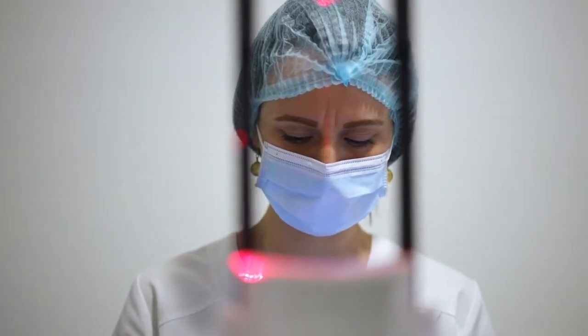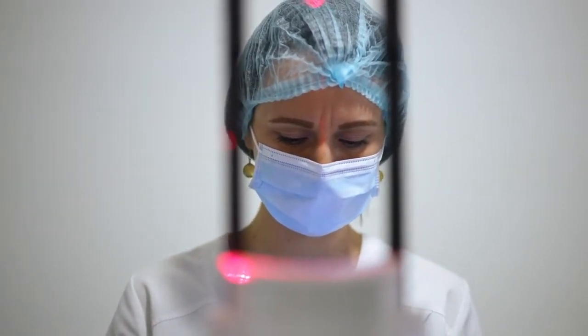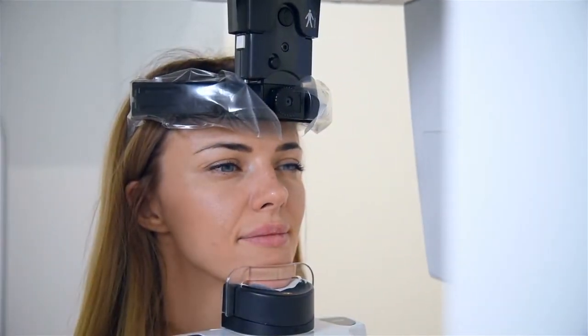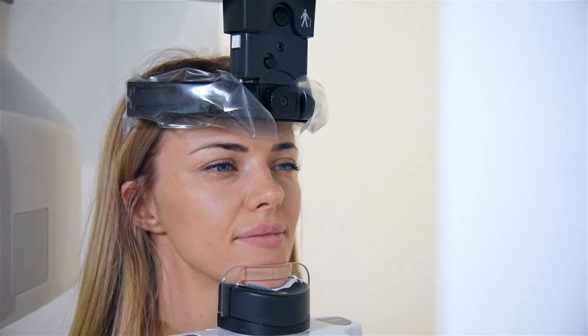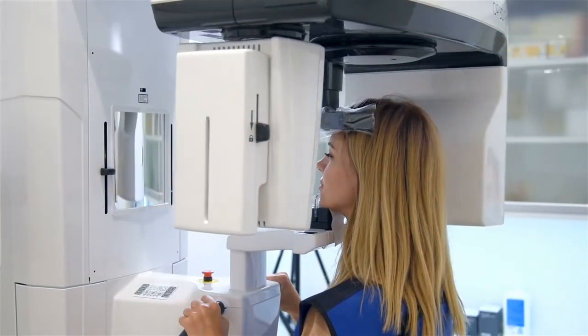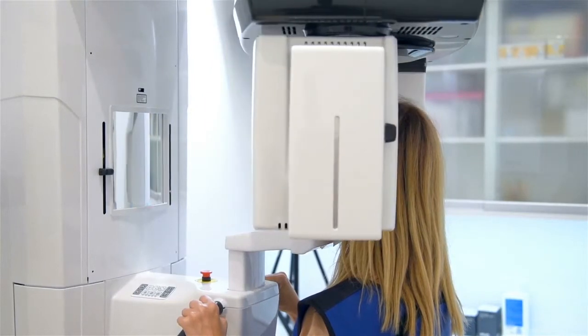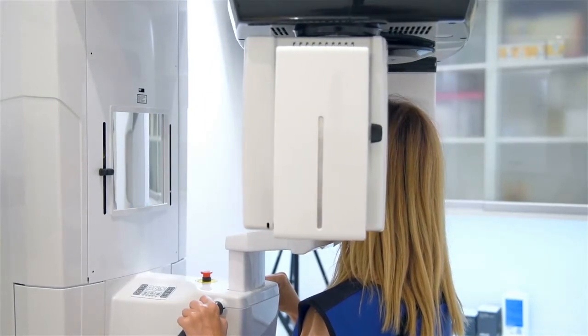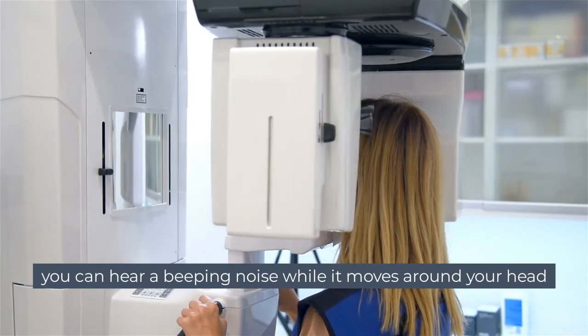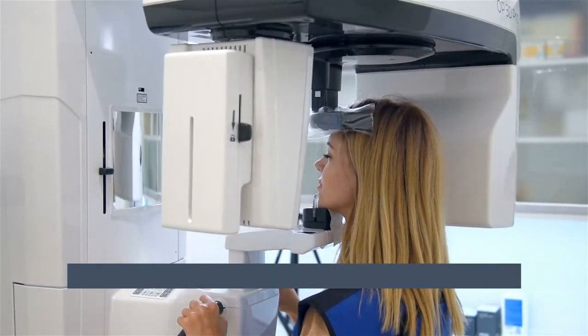Then the technician will walk out of the room, or at least a 6-foot distance away from you, and press the button. The machine will go around your head. It usually takes less than 20 seconds, but every machine may differ slightly — it won't usually be more than 30 seconds. When the x-ray is being taken, you will usually hear a beeping noise while it moves around your head.